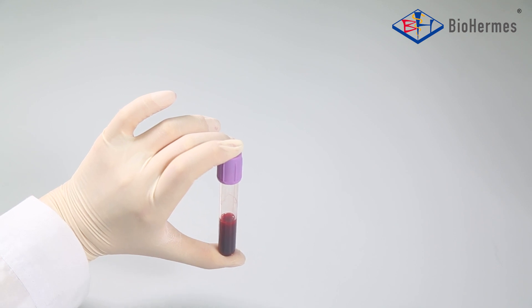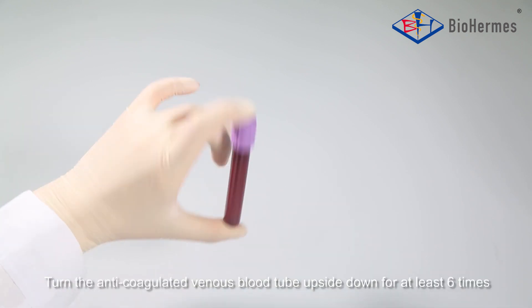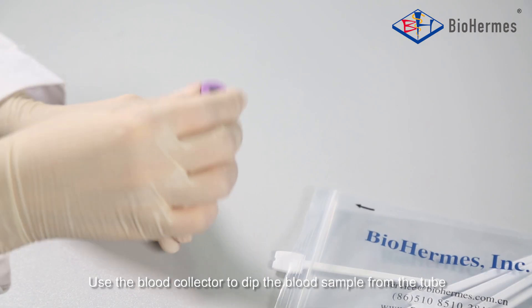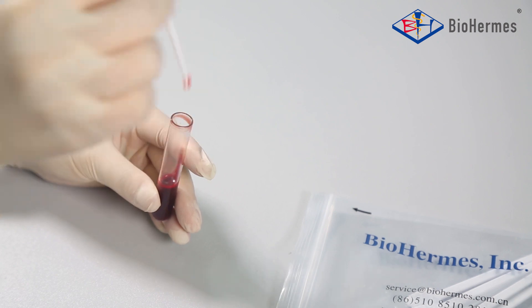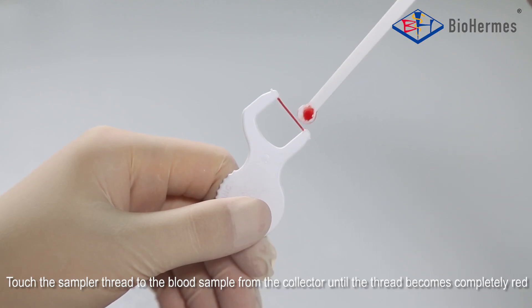Venous blood: Turn the anticoagulated venous blood tube upside down for at least 6 times. Use the blood collector to dip the blood sample from the tube. Touch the sampler thread to the blood sample from the collector until the thread becomes completely red.